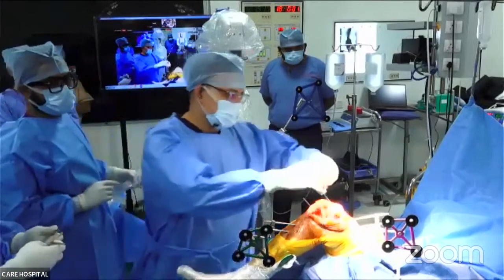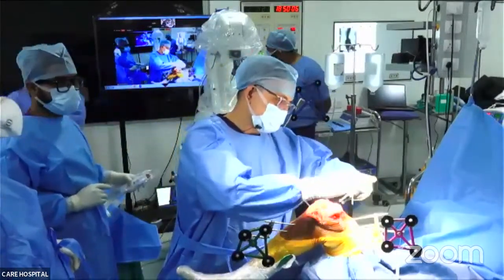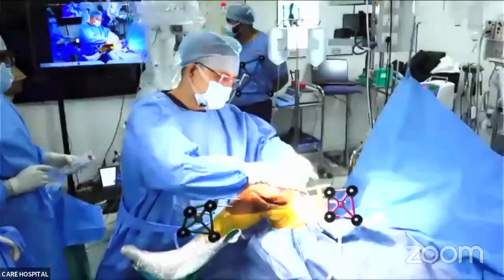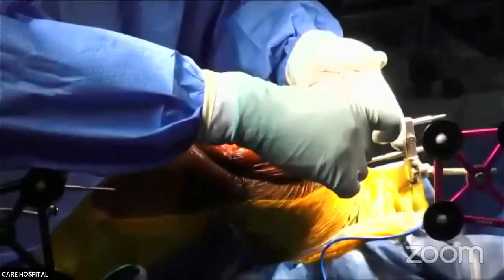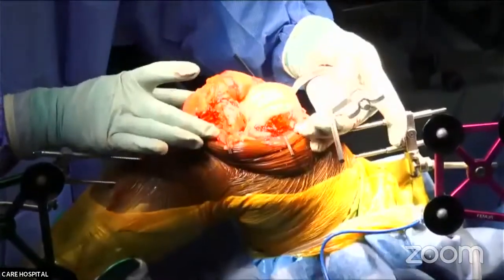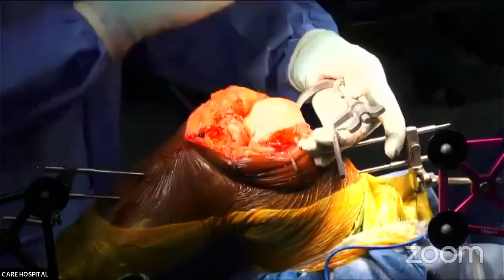Okay. So you can use these clamps also instead of these pins. You can fix the clamp here on the femur, and then there's another clamp for the tibia, and then you can use these clamps to fix the robot.